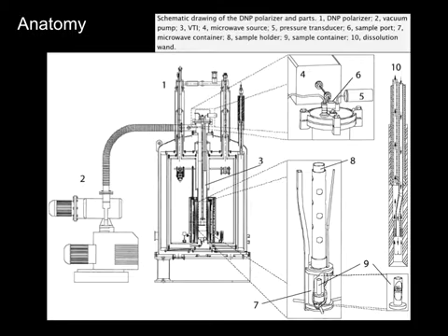Couple interesting things about this. The microwave system is like 90 gigahertz for a 3.35 T magnet, like the Hypersense, and it's a fairly obscure range of microwaves. There's not really a lot of practical stuff that operates in this range, so the sources are pretty obscure.